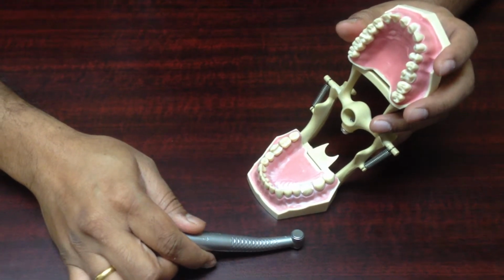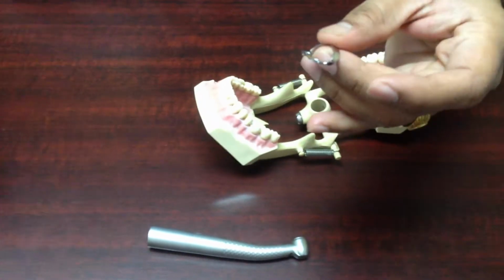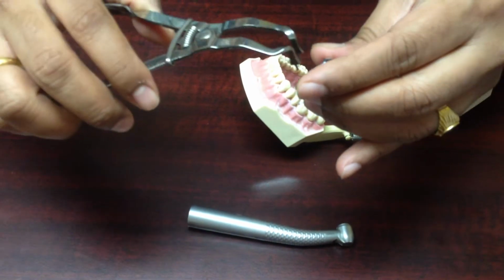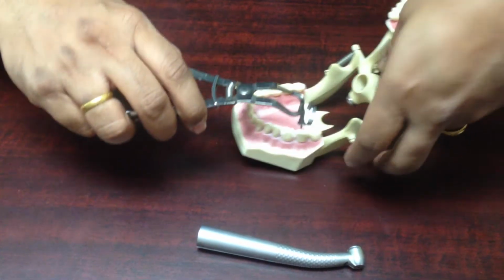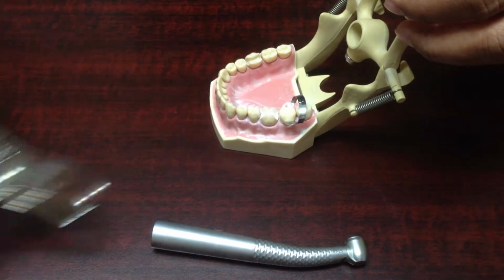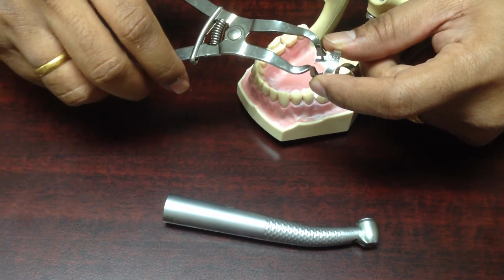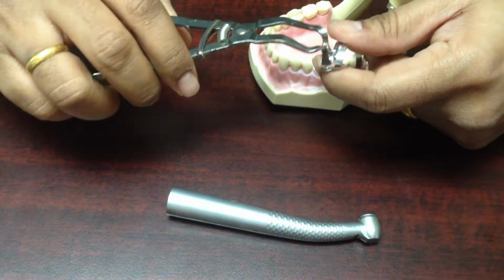An idea I have for the rail system is, these are called clamps. We use these for different purposes, but you don't need to look at how I'm doing this, but once I put it on, how that's going to look, because that's how I want the drawings to reflect. We put these on our teeth, and they grab the teeth from the side. So this is one of the ways that I was thinking I can come up with the rail system, is have the rail system be clamp mounted, like this, for example, or we can always turn the clamps around.